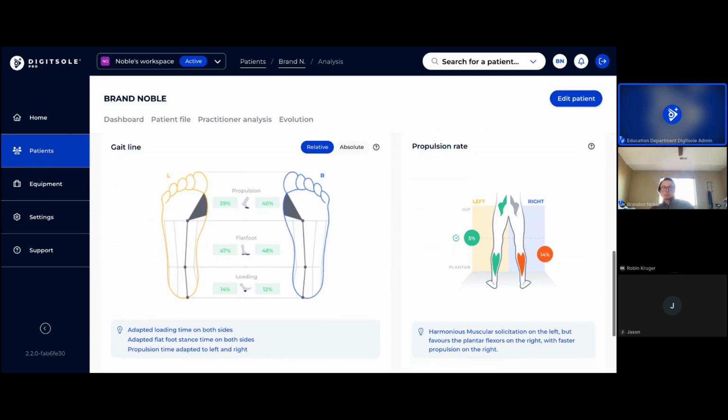Because that's going to indicate that they are with heel inversion or a supinated foot when they heel strike. And then, of course, that reduces when they go into that foot flat position. And then we get ready for propulsion or toe off, and that's going to force us over to that first and second ray. So that trajectory pattern looks really symmetrical, and it looks fairly normal.